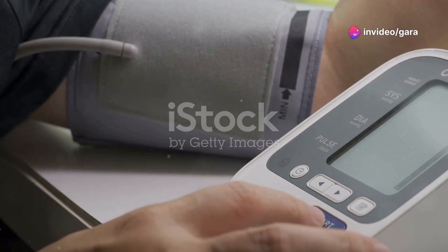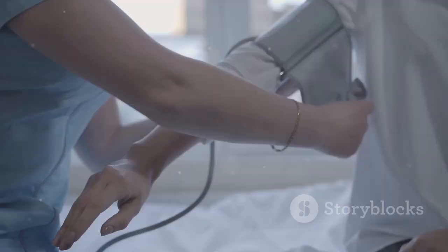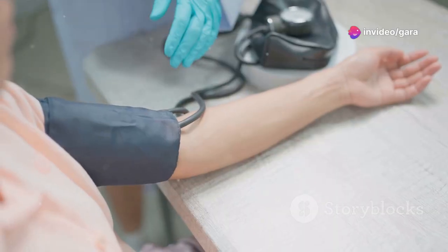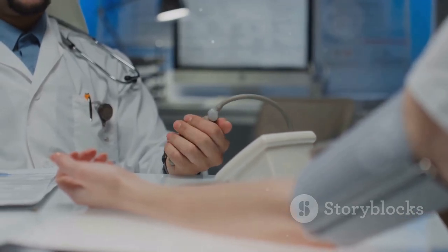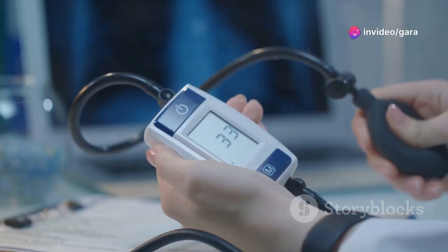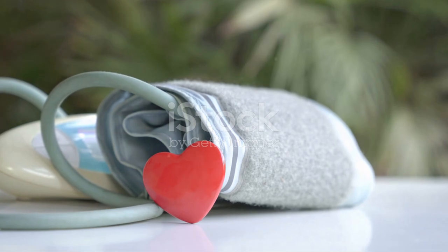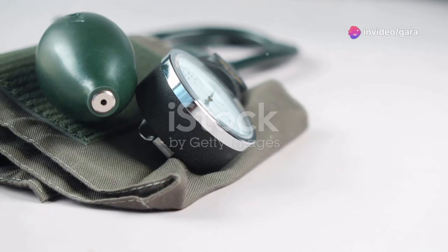First things first, let's break down the components involved: a pump, a valve, and a pressure sensor. These three work together to give you accurate readings of your blood pressure. So, how does the oscillometric method actually work? Imagine you have a cuff wrapped around your arm. The process starts when the pump inflates the cuff, squeezing your arm tightly. This inflation temporarily stops the blood flow in the brachial artery. Now, here's where it gets interesting. The pressure sensor comes into play. As the cuff slowly deflates through the valve, the sensor detects tiny fluctuations in pressure.